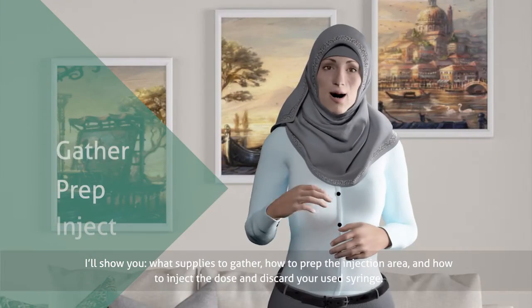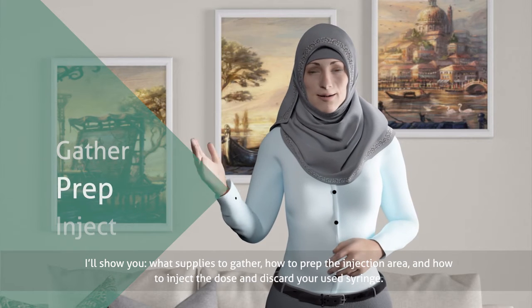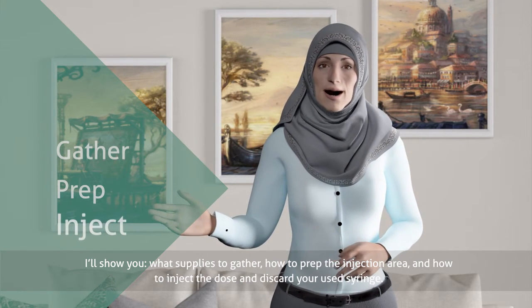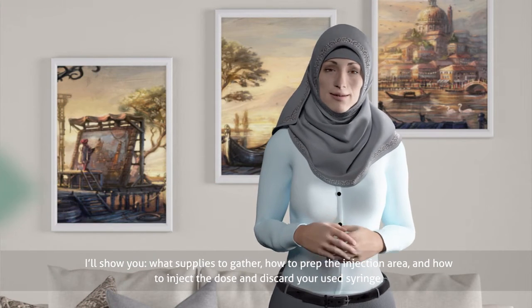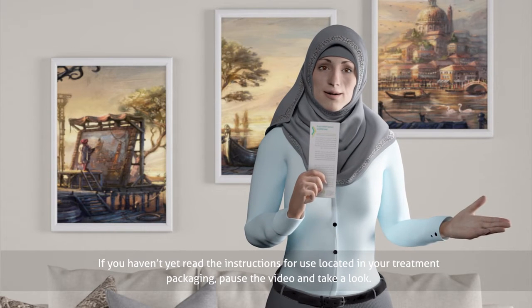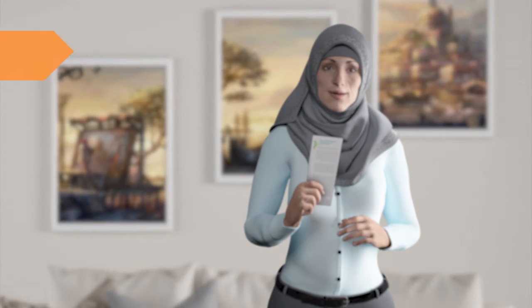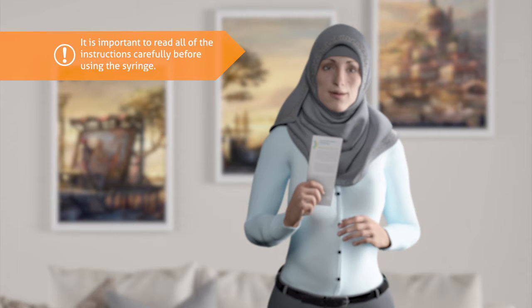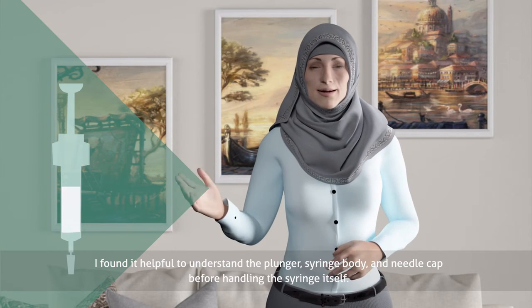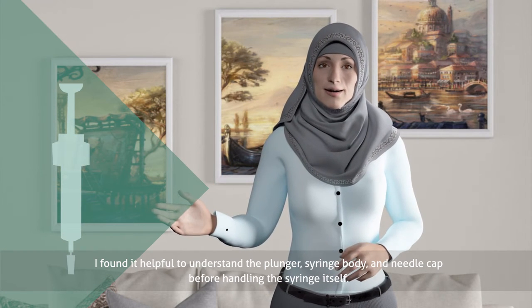I'll show you what supplies to gather, how to prep the injection area, and how to inject the dose and discard your used syringe. If you haven't yet read the instructions for use located in your treatment packaging, pause the video and take a look. It is important to read all of the instructions carefully before using the syringe. It's helpful to understand the plunger, syringe body, and needle cap before handling the syringe itself.